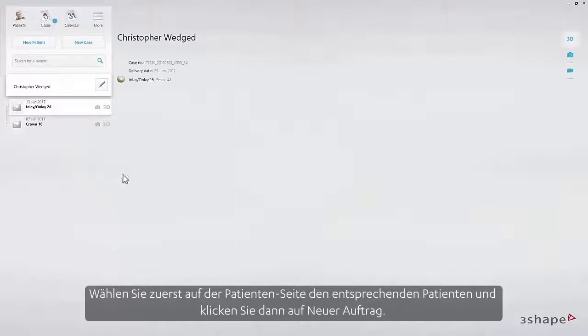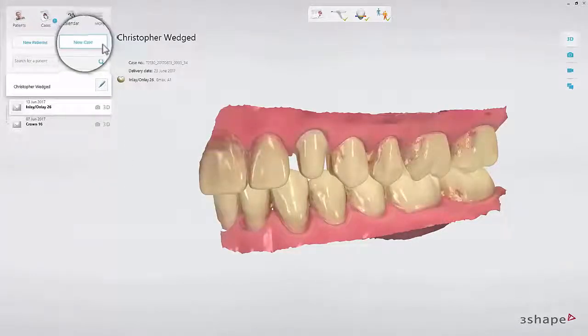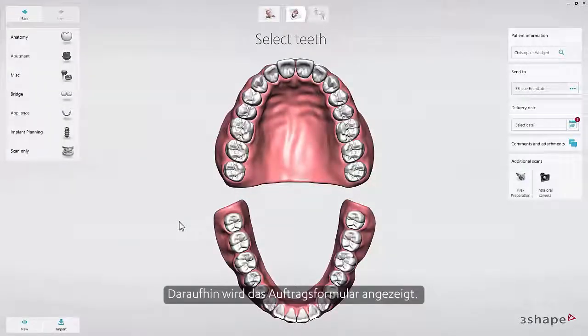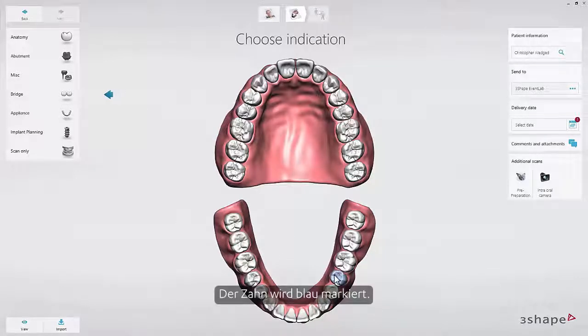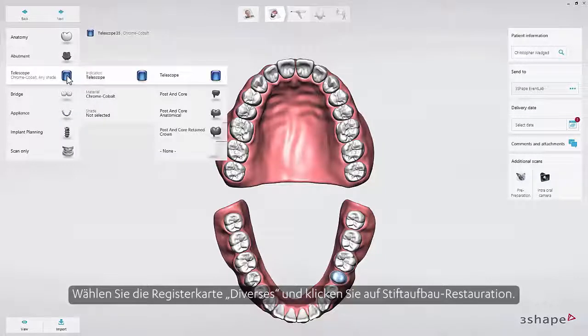Starting on the Patients page, select the patient, then click New Case. Select Lab. The order form will appear. Select the tooth that needs to be restored — the tooth will be highlighted in blue. Choose the Miscellaneous tab and select Post and Core Restoration.